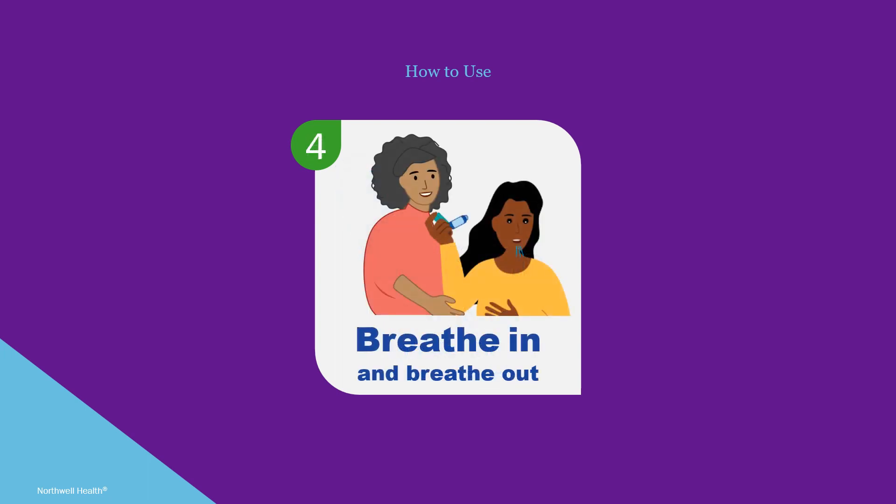Next, breathe in and then all the way out. Using a spacer and mouthpiece requires coordination, so children less than six years of age benefit from using a spacer and mask.